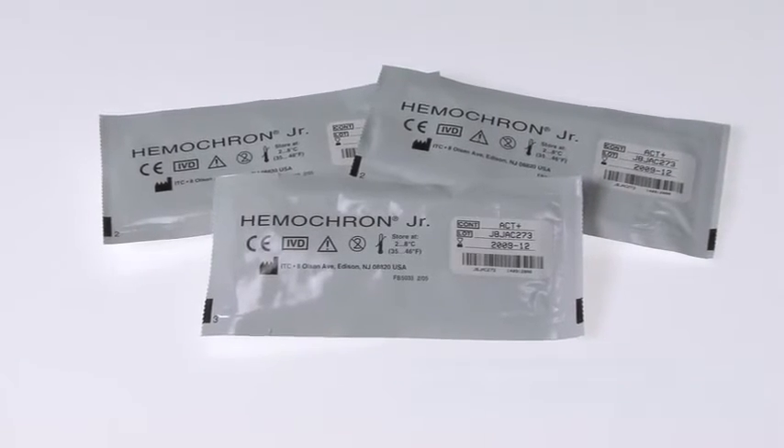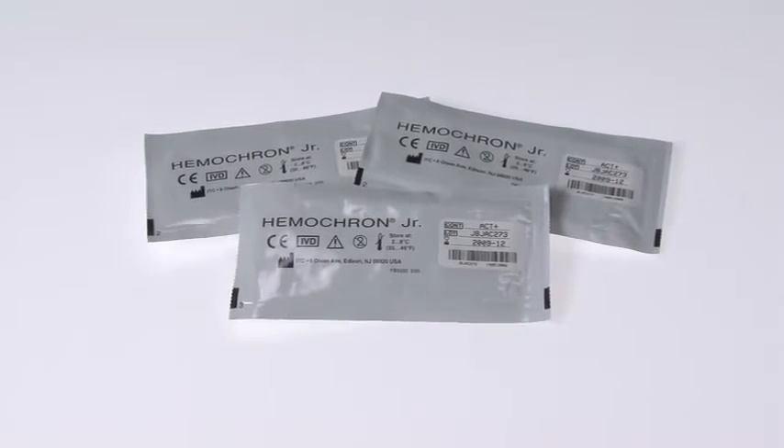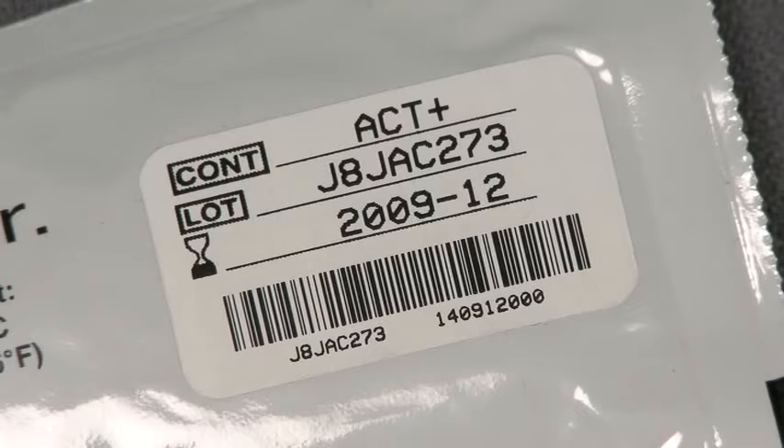If the cuvettes have been refrigerated, they must be brought to room temperature before use. Note that the cuvettes are individually pouched, and each pouch provides the test type, lot number, and expiration date. This information can also be easily scanned into Elite using the barcode on the pouch.